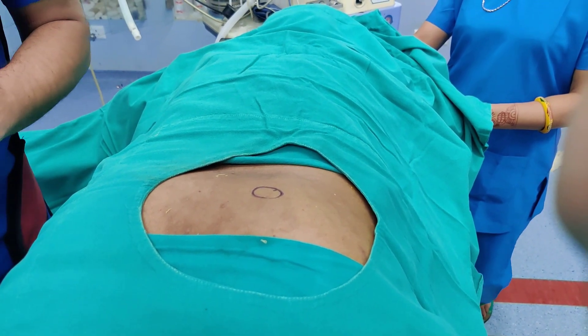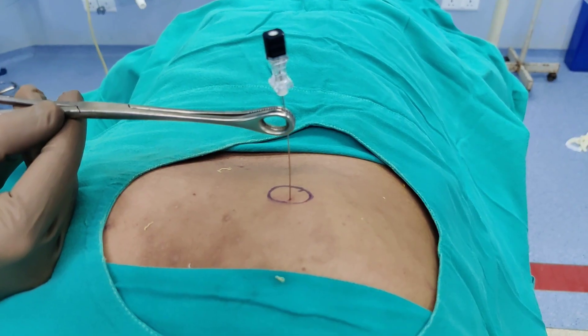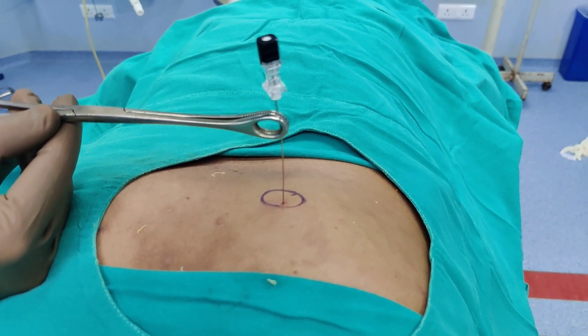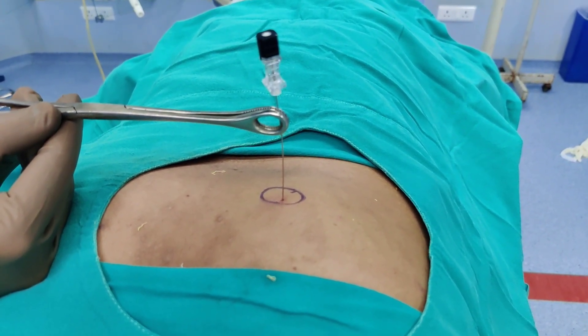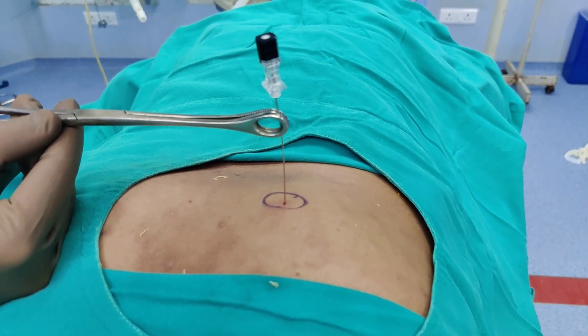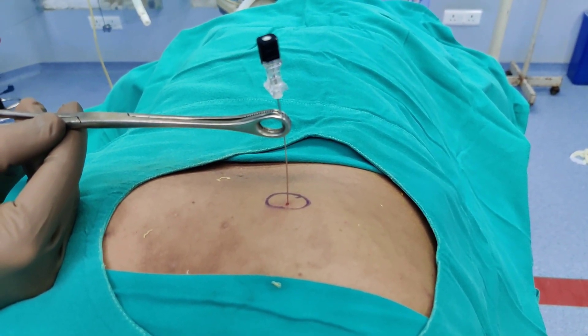The next step is to insert the spinal needle. I hold the spinal needle with a sponge holder so that my hands are not exposed while taking X-rays. We will then take a shot and I will show you how it should look on the C-arm.